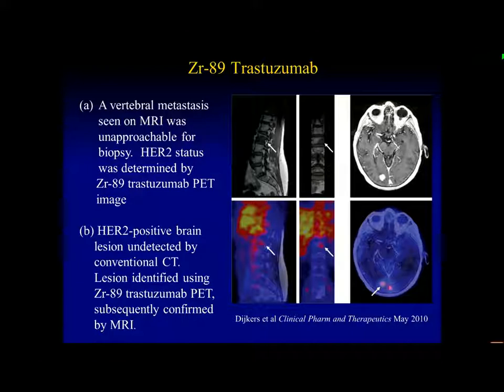And this is a HER2-positive brain lesion, which was undetected by conventional CT. A lesion was identified using the zirconium antibody, and was subsequently confirmed by the MR.